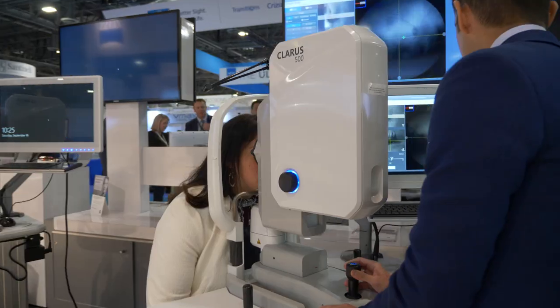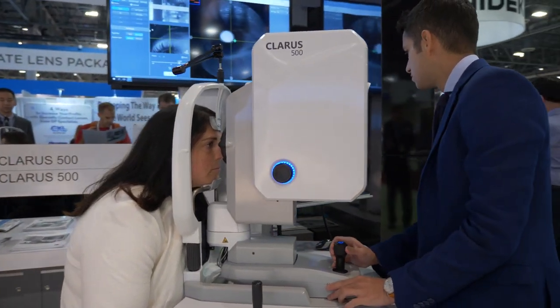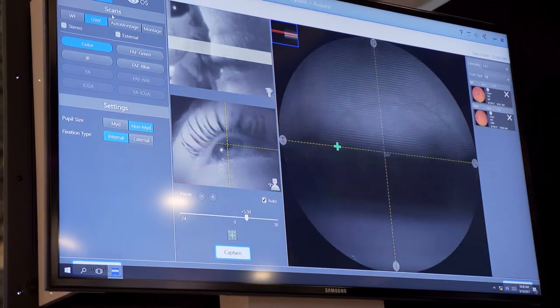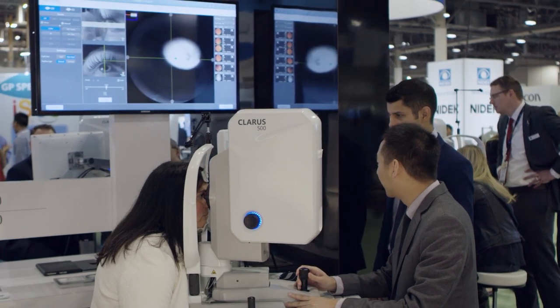The big thing is that you're not bringing the patient to the instrument — you're bringing the instrument to the patient. There's a chin rest, you line the patient up at their temple, just like we're all used to with basically every instrument we use. You don't really need to change the background lighting, so just room lights, and you're able to get great images.